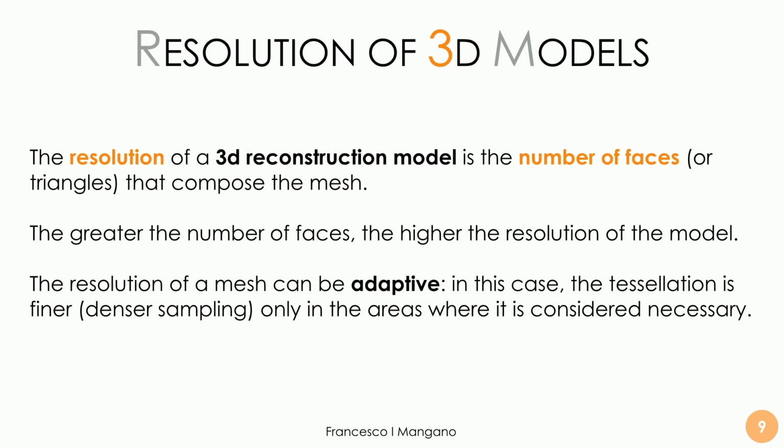Even if I have hundreds of thousands of triangles, I can have a model that is completely untrue. So there's no correlation between trueness and resolution of acquisition. Anyway, resolution of acquisition is very important for a series of reasons.